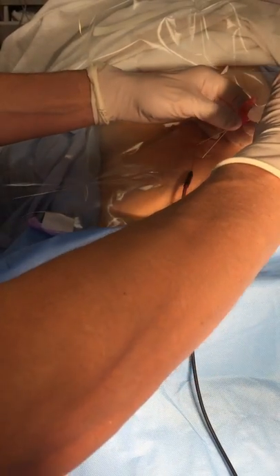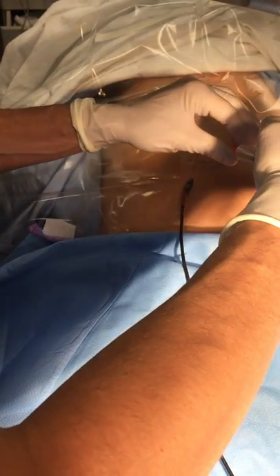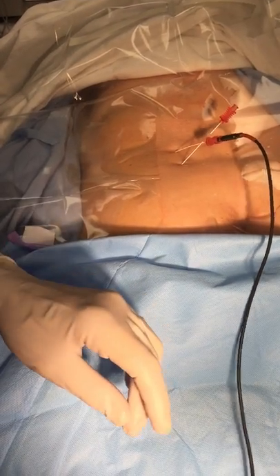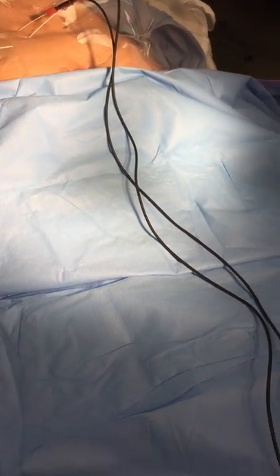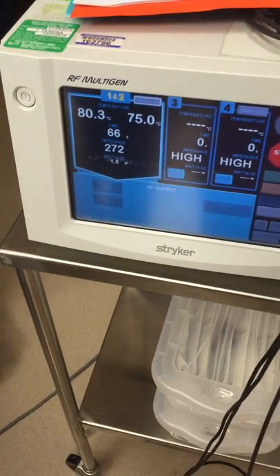Here you see the ablation wires being placed, with injection of some local anesthetic for both intraoperative and post-procedural discomfort. The wires are being placed into the insulated needles, and the ablation will see the two wires connected to the Stryker generator. We are about to ablate the joints at 80 degrees Celsius for 90 seconds.